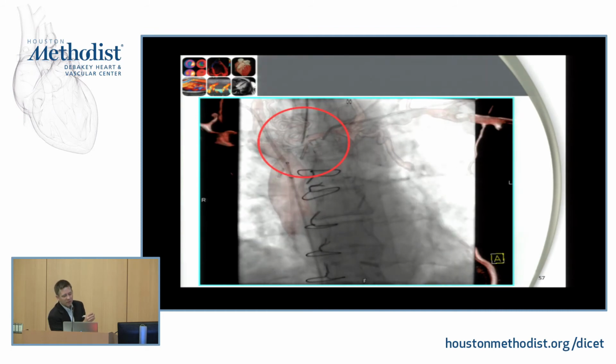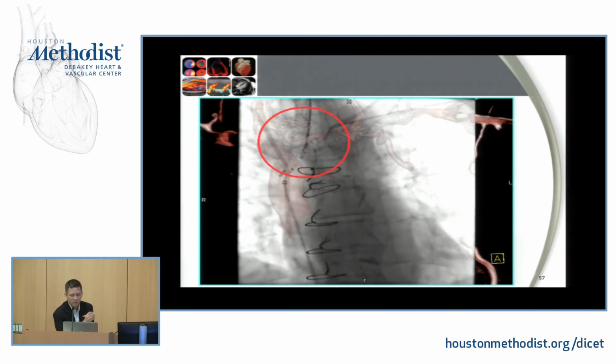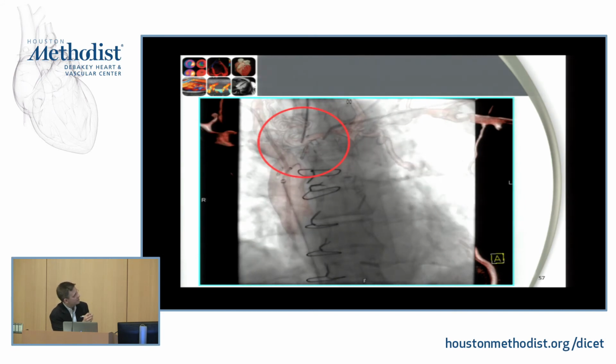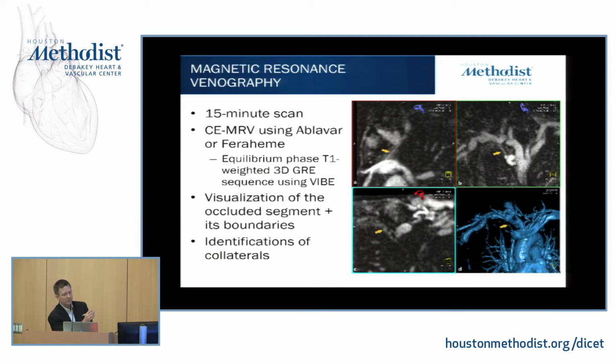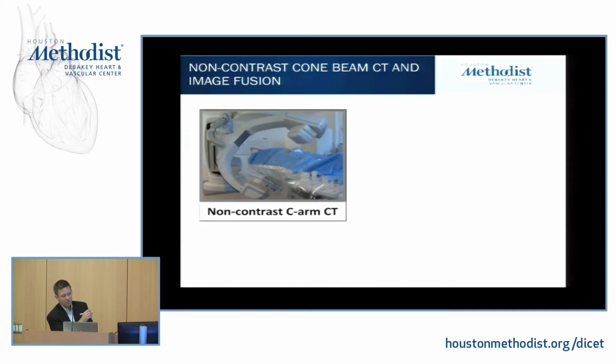With targeted recanalization, though, many times, this is actually using the robot as well, with the overlay and the presence of the robot helping to better direct these catheters and wires so they can go across and achieve something. Here's a challenge, a patient with really no obvious path to follow. Many times with angiography alone, we can figure out where this obstruction is or near obstruction and get through that, but sometimes we need further imaging help. So the patient undergoes the MR scan, basically then to delineate that, and then has the overlay.